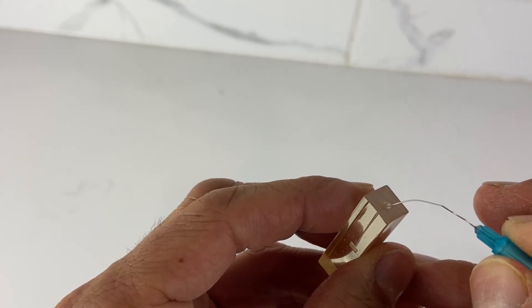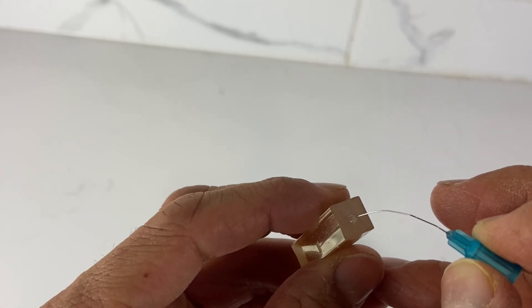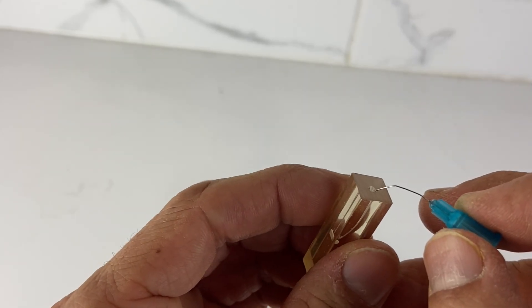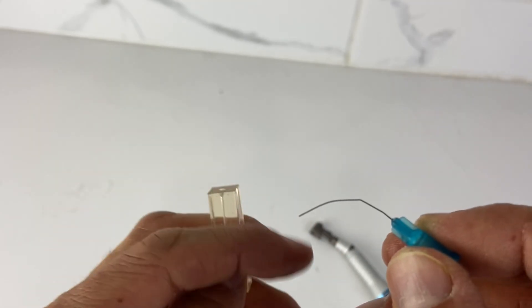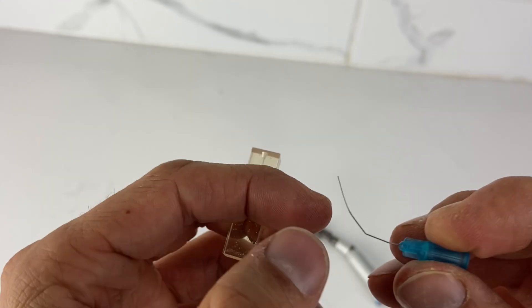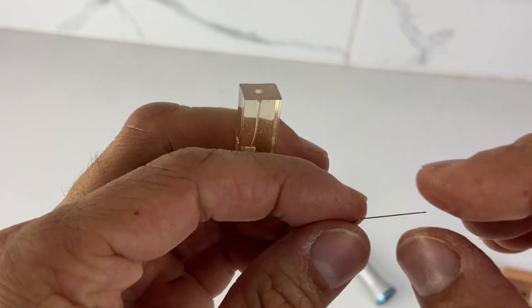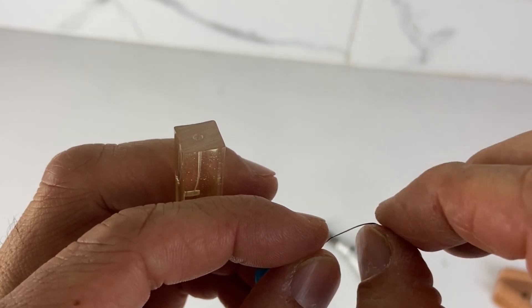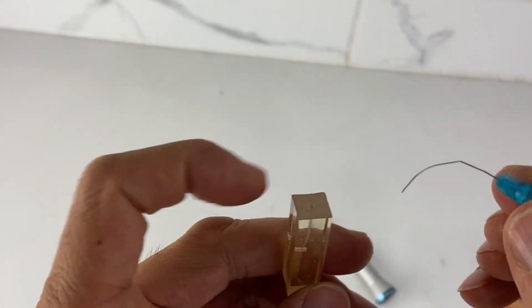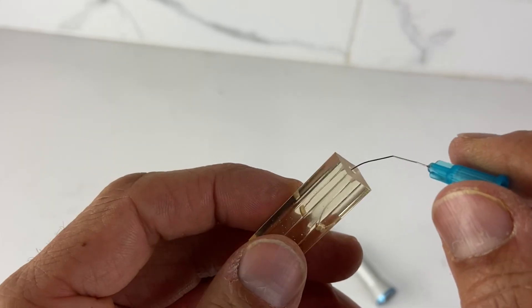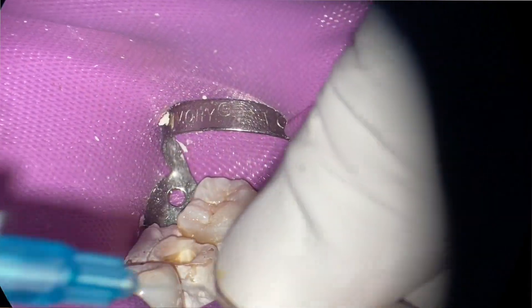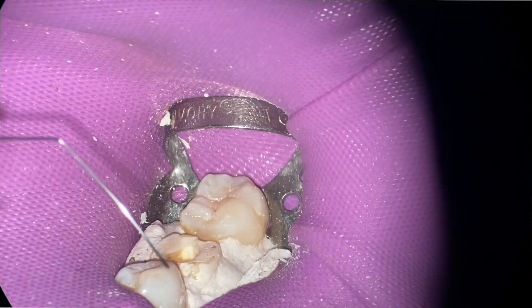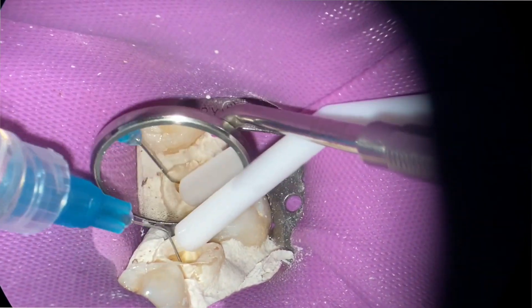Oftentimes if I need to get around a curve, I will actually bend it. If there's a mesial curve and I want to get down, I actually will bend after I've cleaned and shaped everything. So it actually will travel, traverse along that curve. That's not frequent that I do it, but I'll do it here and there.